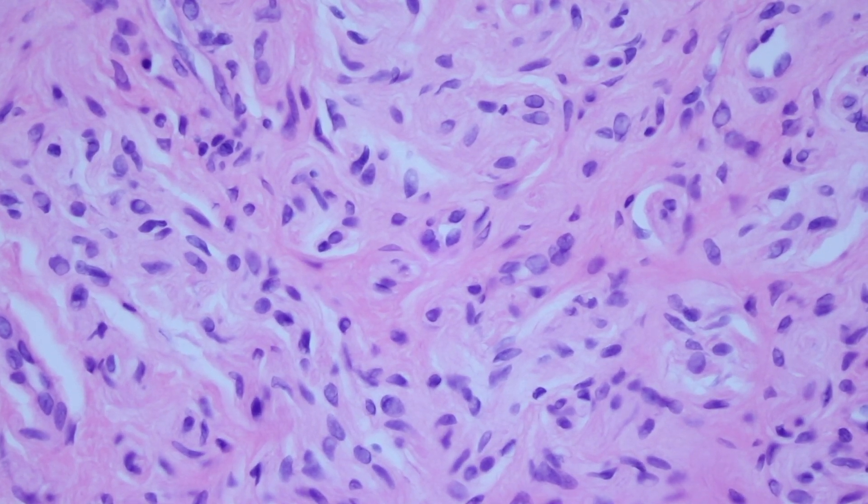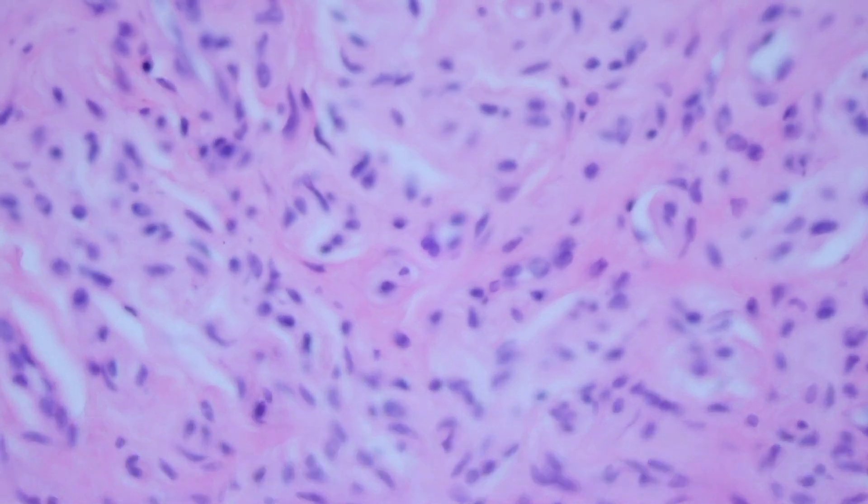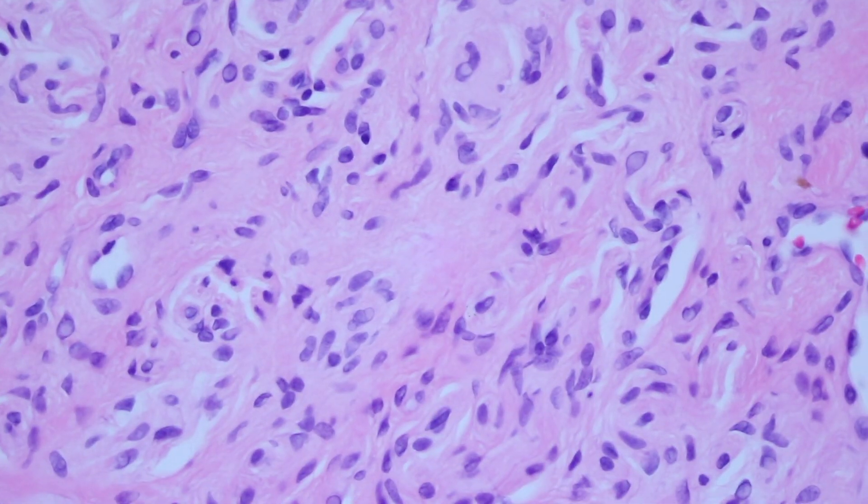Some of them are spindled and look kind of bent or curved or crooked. Some people say that these are wavy, but that terminology doesn't usually resonate well with me for these. But these are Schwann cells.